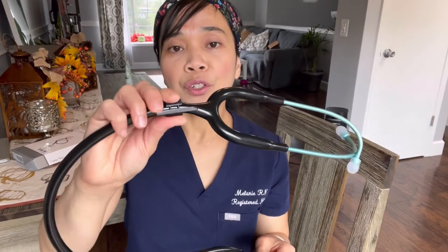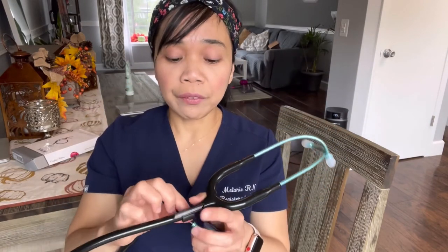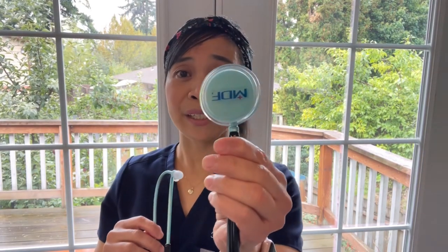There is an ID tag right here that you can write your name on and clip it on this part of the tubing. Unfortunately, they are not offering engraving on this specific series, but they do offer it on their other stethoscopes, which you have to pay more for. And now let's talk about the head of the stethoscope.